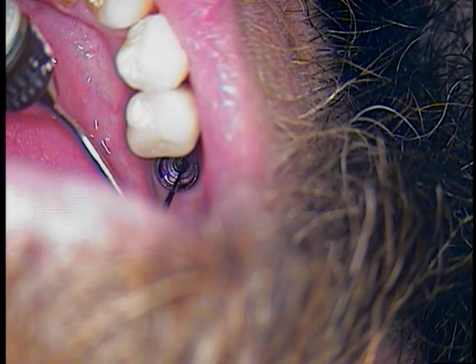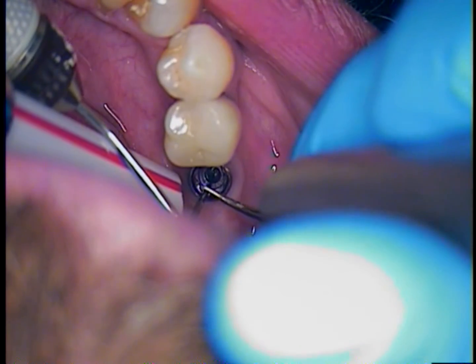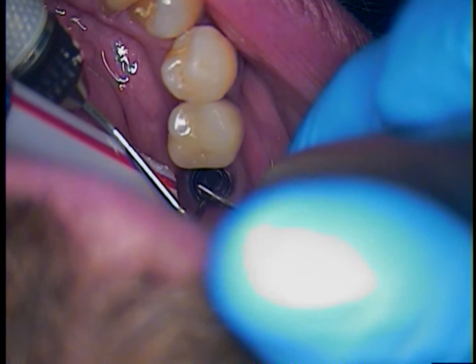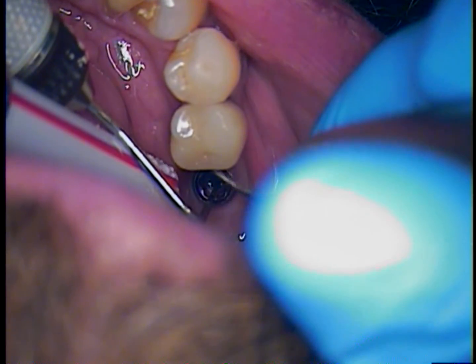Obviously it's not working, and you have to think: what's the easiest way to approach a case like this without traumatizing anything? So now I'm remeasuring, and I'm going to use an ultrasonic — I'm going to touch a periodontal probe with the ultrasonic using some water and see if I can stimulate any movement in the broken screw and get it to come loose.